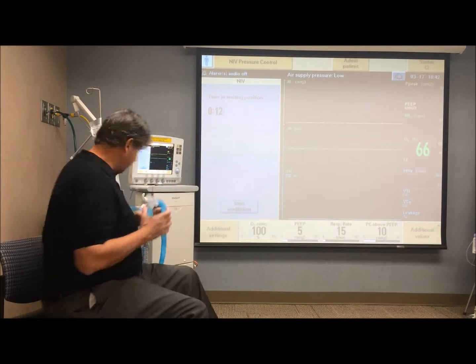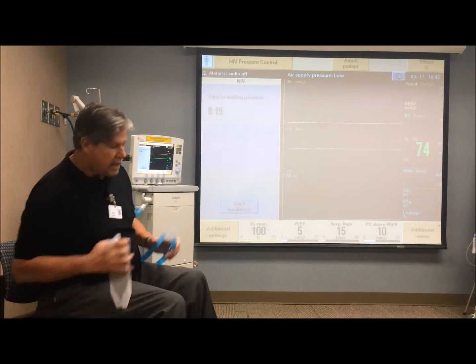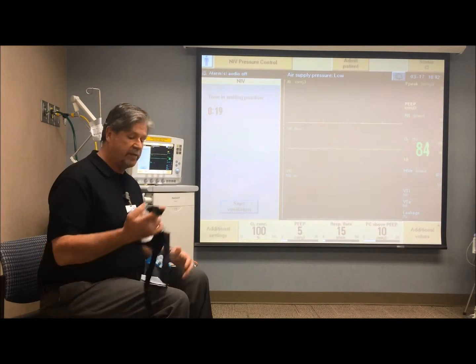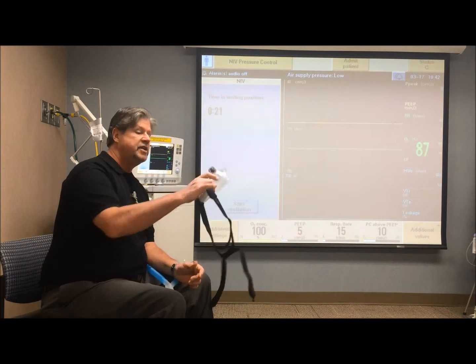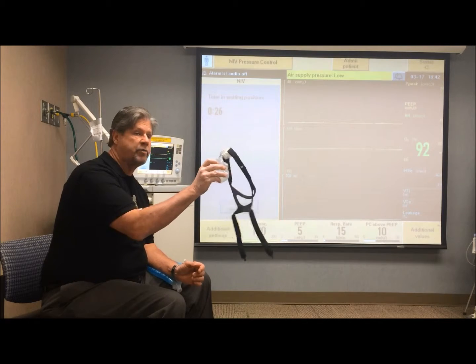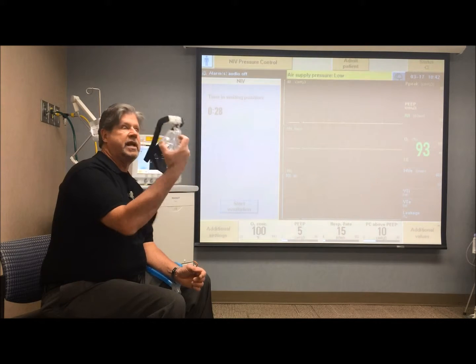of non-invasive ventilation, we have Mr. Smith here who's a little apprehensive and say, all right, Mr. Smith, we're going to be putting this mask on your face, so just breathe normally. We're not trying to suffocate you or do any harm to you. Just breathe normally. But yet when you're Mr.